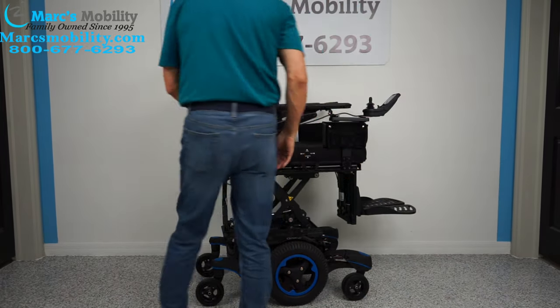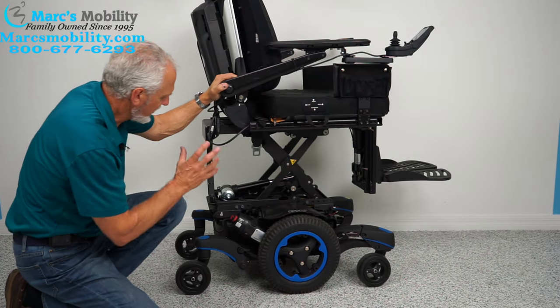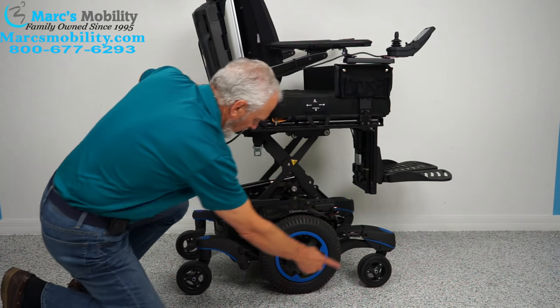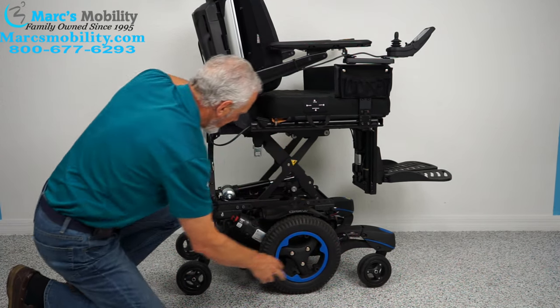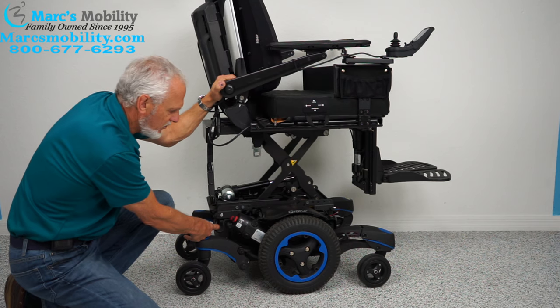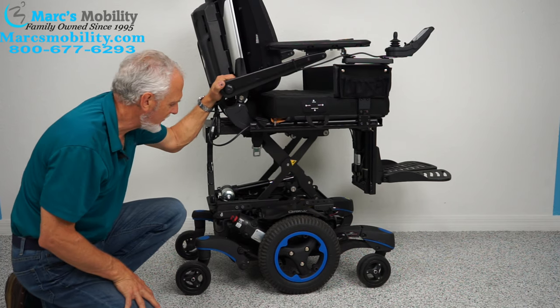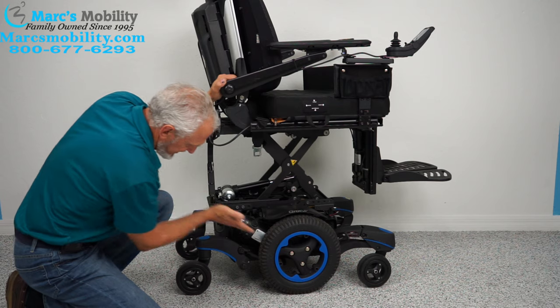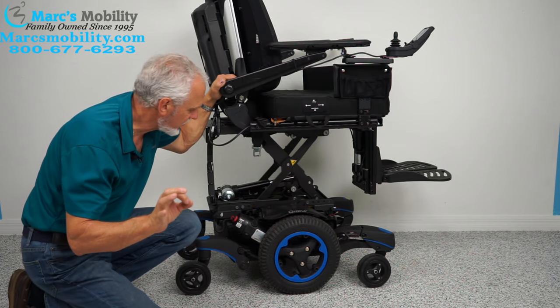Now let's look at the base. Sunrise Medical makes a really good chair. You can see 14-inch solid wheels that will not mark your floor, front and rear caster wheels, and two anchor points for securing the chair to a lift when transporting it in a van. This chair weighs 425 pounds — it's all metal and very heavy.